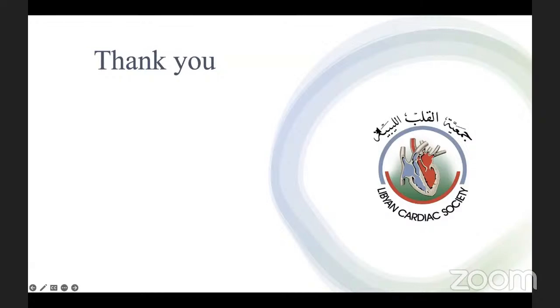Sure. Assalamu alaikum. Thank you very much, Basem. You did a fantastic job summarizing this very broad topic. It's complex. I just have a few comments about the technicality of the right heart cath. As we know, we have three approaches. We can go from the neck, or from the groin, or from the arm. I usually prefer to go from the arm, especially if it's just diagnostic. If we're going to leave the catheter, I usually go from the neck. But if I'm going to do just diagnostic, I go from the arm.